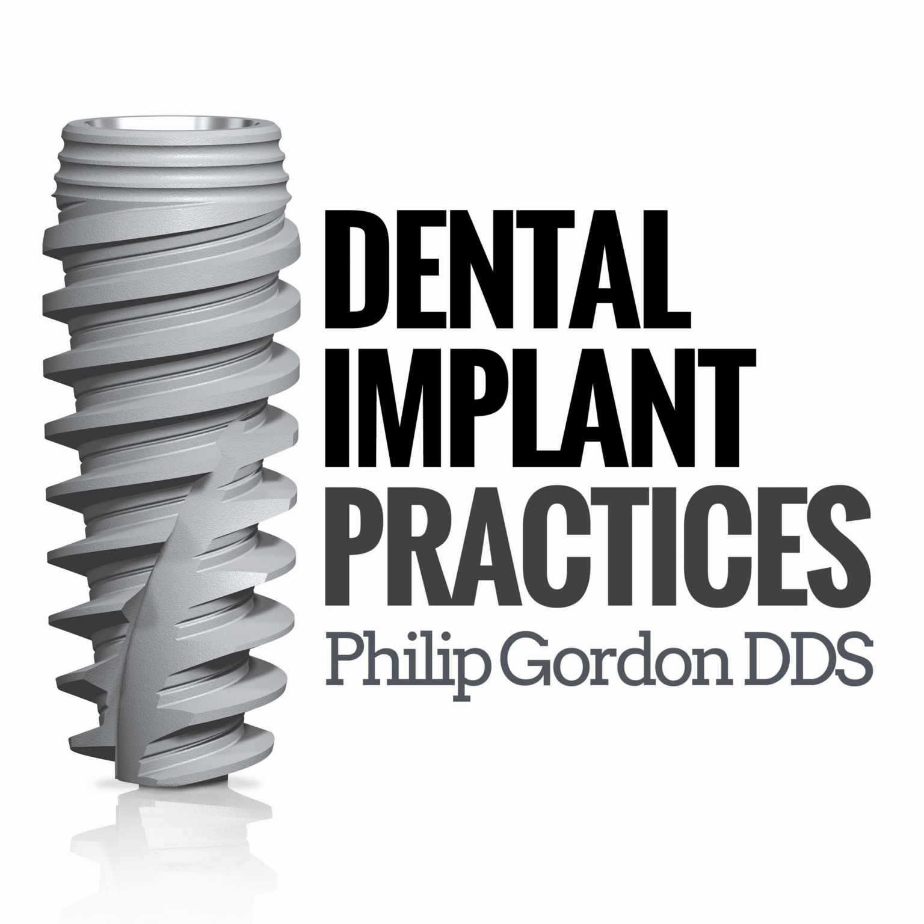Now, if the patient needs more bone, let's say they're missing number 2, 3, and 4, and they've got a greatly pneumatized sinus, and they only have about 5-6 millimeters worth of bone, and they really need more significant augmentation, then of course we're doing the lateral access full open sinus lift. And what I like to use for that is the piezotome. For those who are not familiar with it, the piezotome is an ultrasonic cutting instrument.